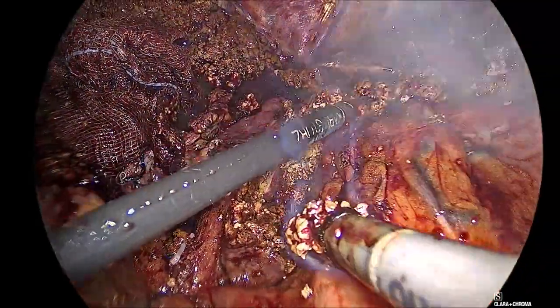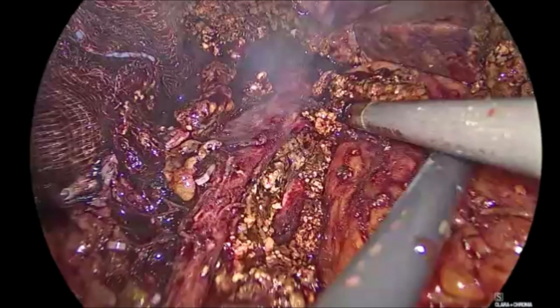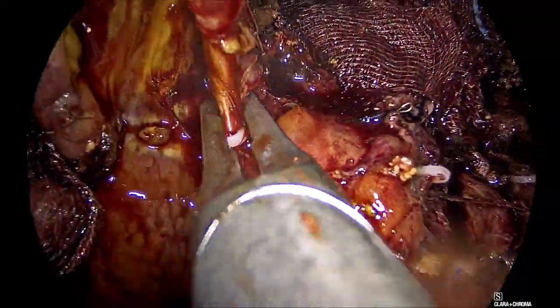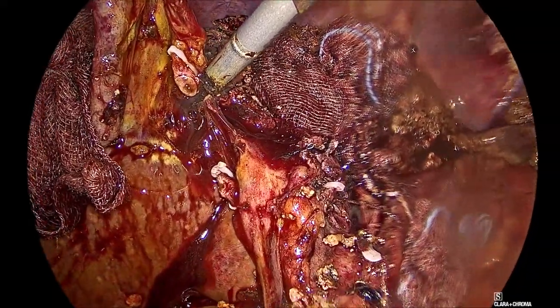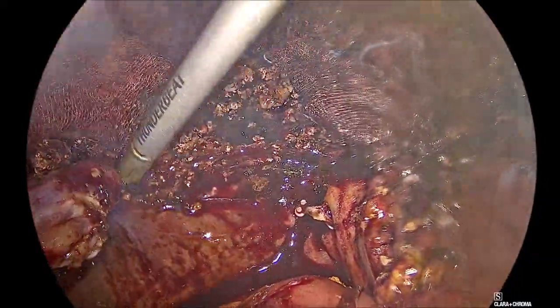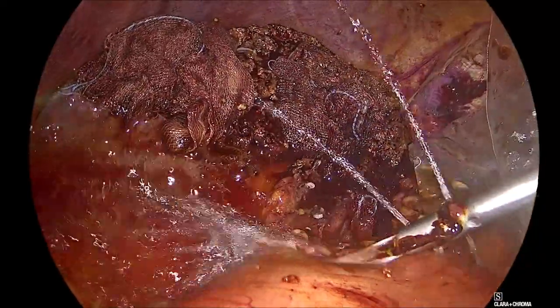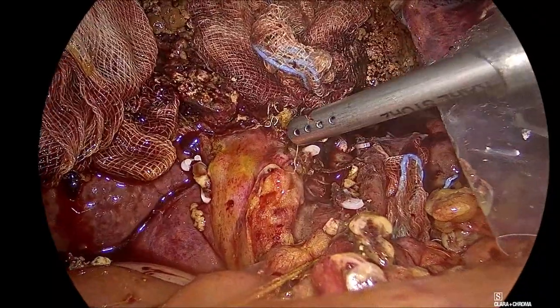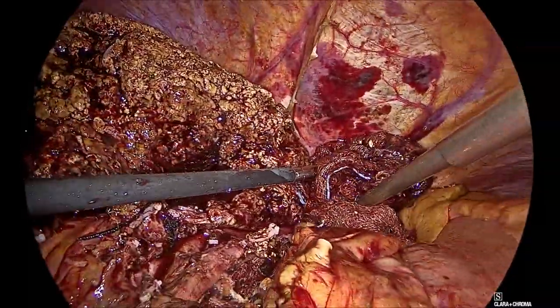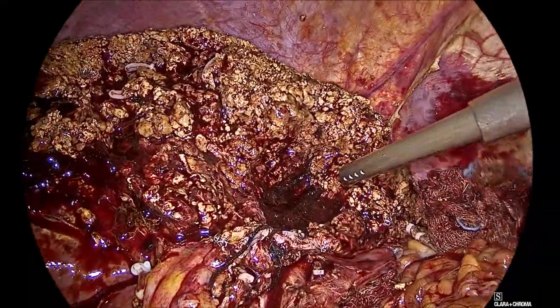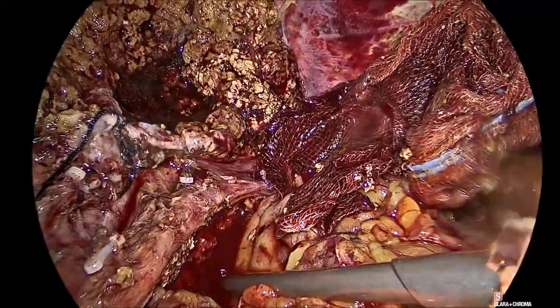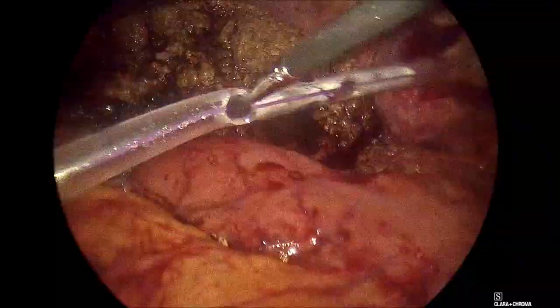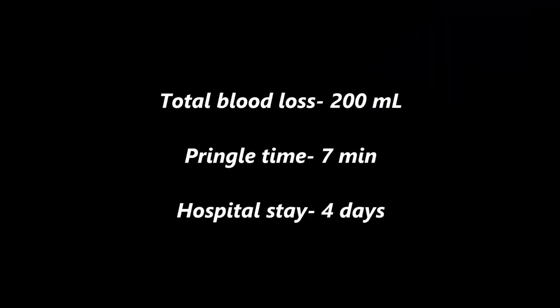Care was taken to avoid inadvertent injury to the IVC, as pulling the caudate lobe risks IVC injury. The IVC was exposed from within the caudate lobe, and caudate lobectomy was completed. Cholecystectomy was then performed; the gallbladder was inadvertently opened during dissection, causing a bile leak from the gallbladder. After specimen removal, a thorough wash was given and hemostasis and biliostasis were ensured. A fresh gauze piece was placed to confirm no residual bile leak after specimen removal. A doubtful segmental branch was clipped for safety, a drain was kept, and the procedure was completed. The patient was discharged on postoperative day 4.